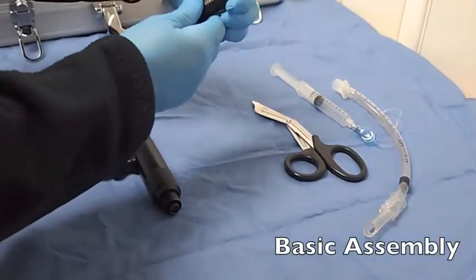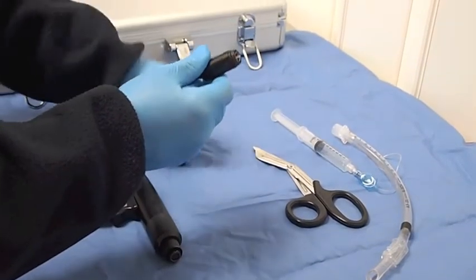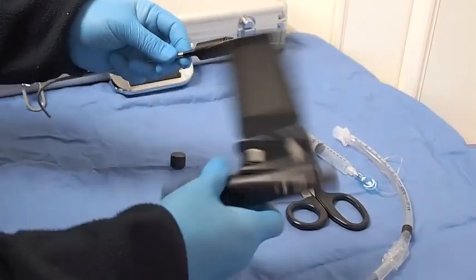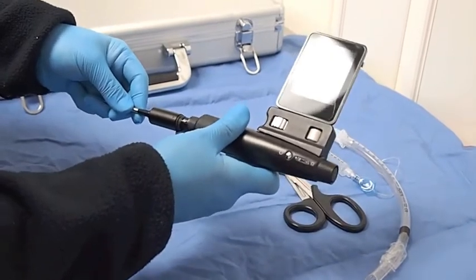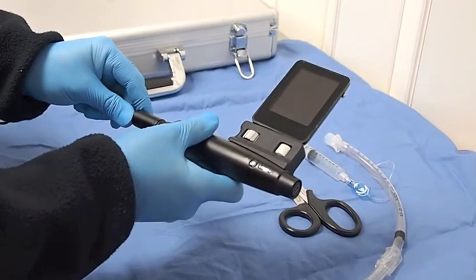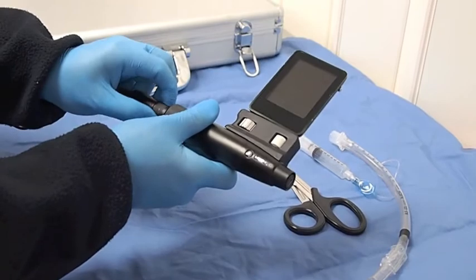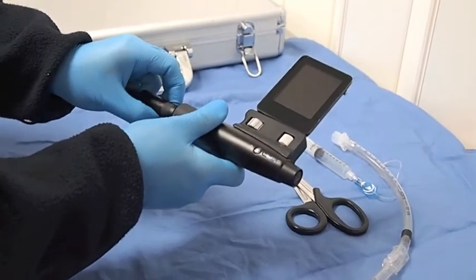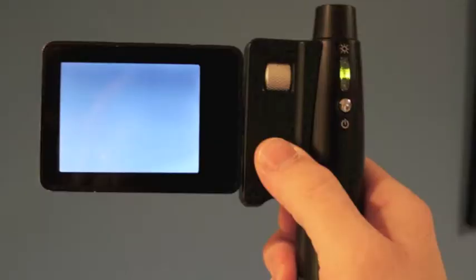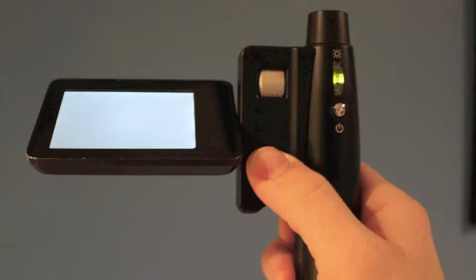Basic assembly of this device is relatively simple. Remove the cap used for storage and cleaning. Place the stylet on the main unit and secure into position. The device swivels utilizing your thumb, as shown here. This is to allow you to keep the screen in view during movement of the device required for proper technique in intubating.